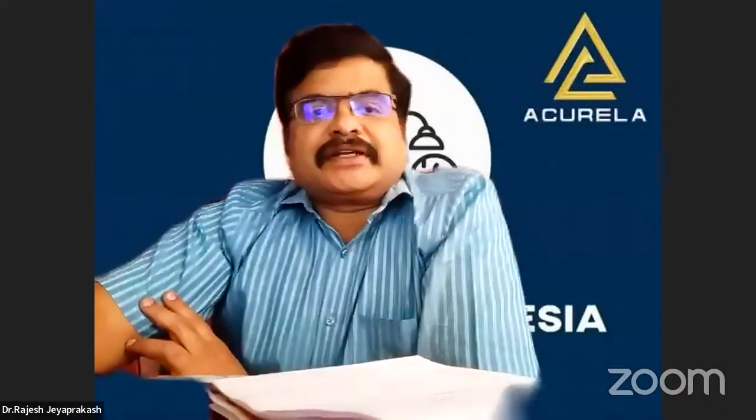So what is the role of PAC over transesophageal echo? Is it reliable for cardiac output monitoring? Which one is reliable, the pulmonary artery catheter or transesophageal echo? Sir, it is not the technique whose reliability we actually compare. It depends more upon the clinical scenario of the patient. When you have a patient who is intubated and has complications, where we have to monitor the hemodynamic status, if there is an available transesophageal echo, I would first start off with the transesophageal echo.